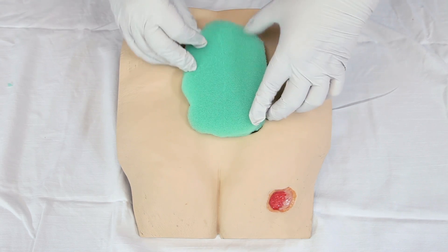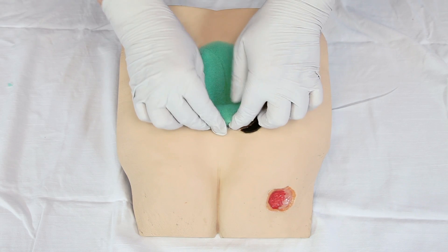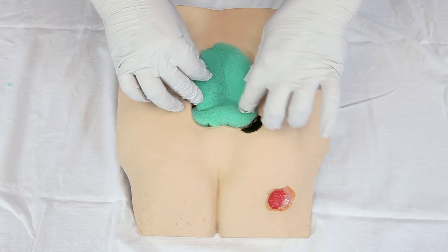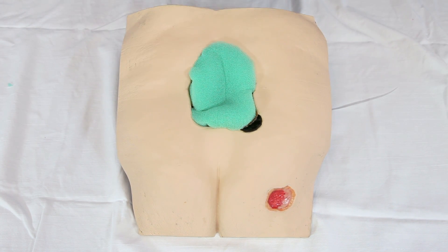Apply the dressing into the wound bed, assuring to cover all areas of the wound bed including undermined areas, without over packing, assuring all portions of the dressing are confined within the wound bed.